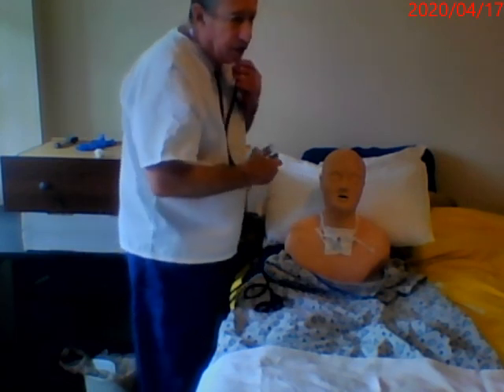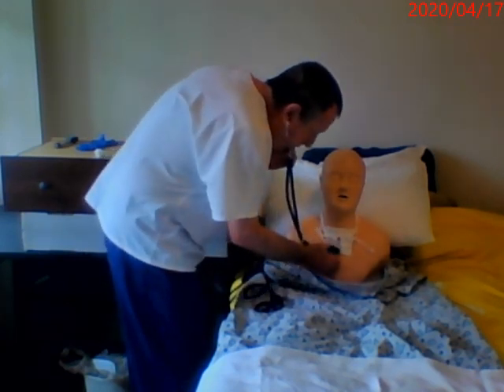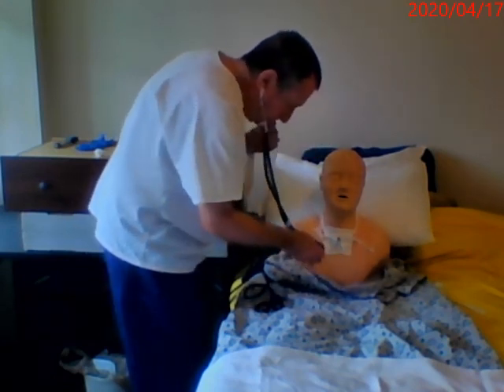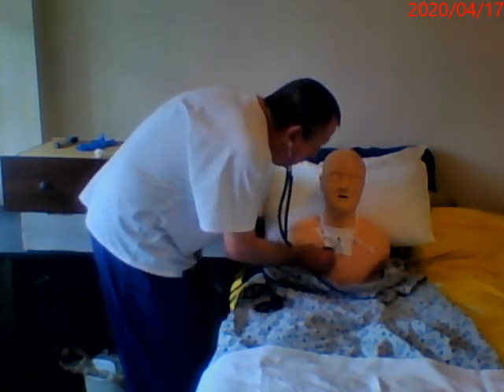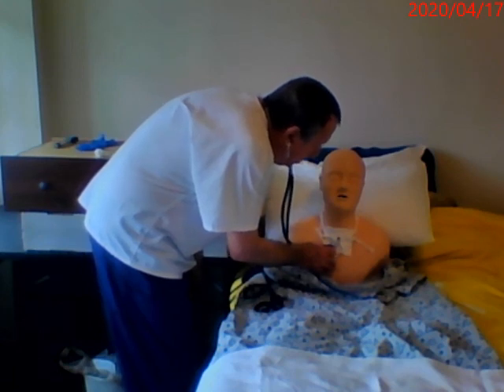I'm going to hear S2 sound best at the base of the heart, and S1 sound best at the apex of the heart, S1 being systolic and S2 being diastolic. So I'm going to check here.